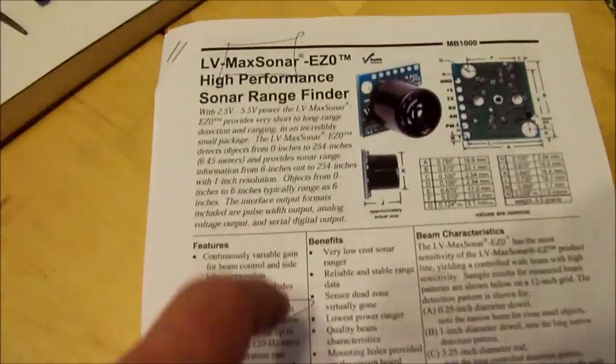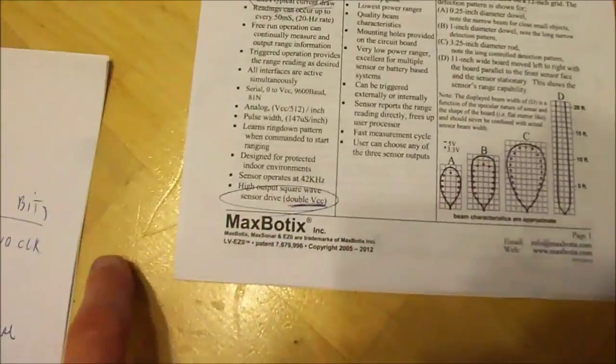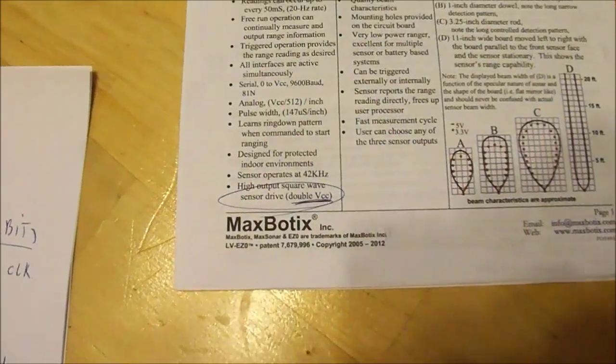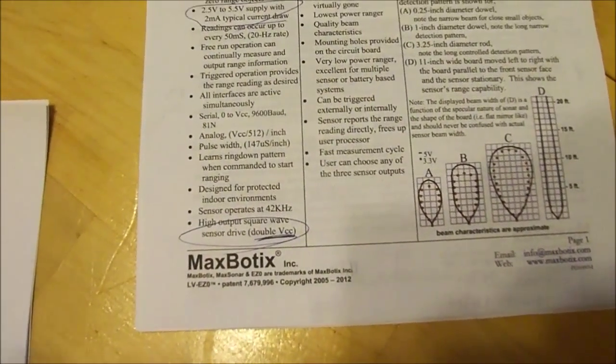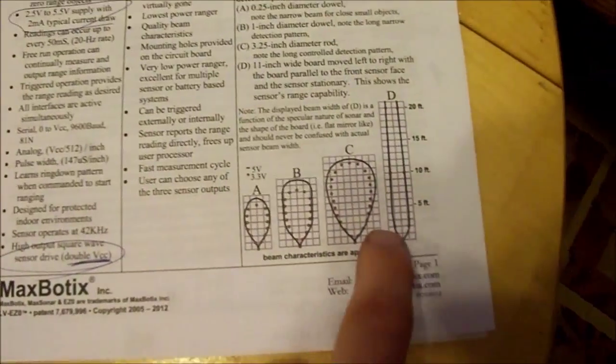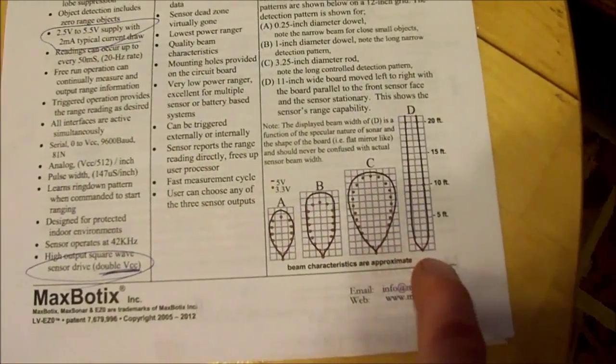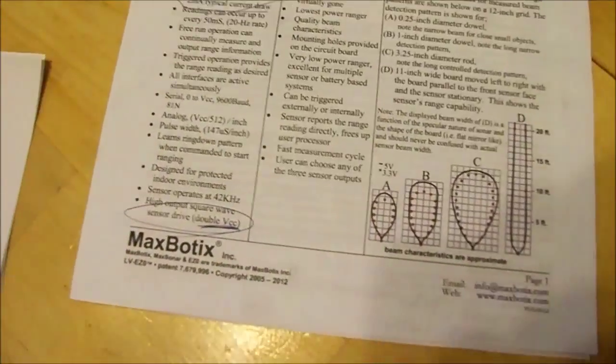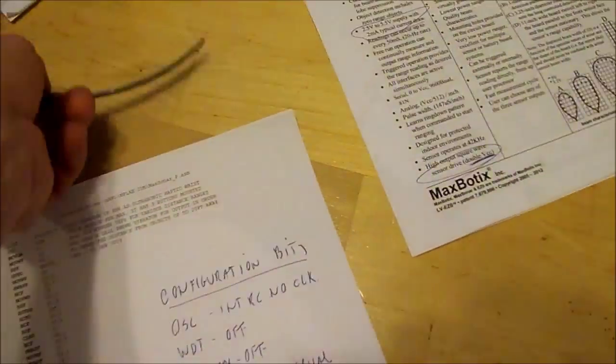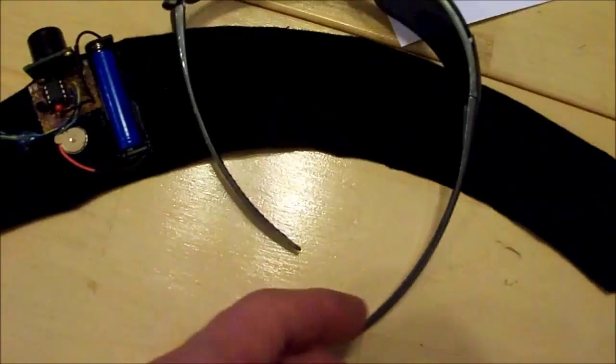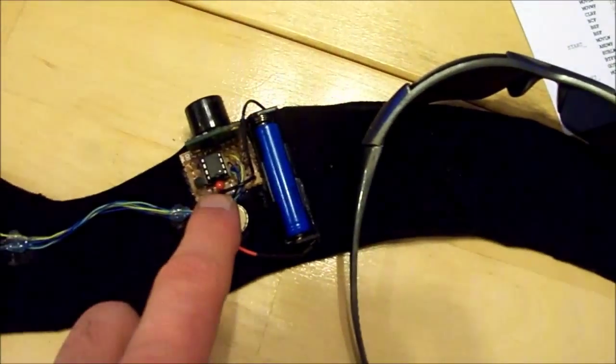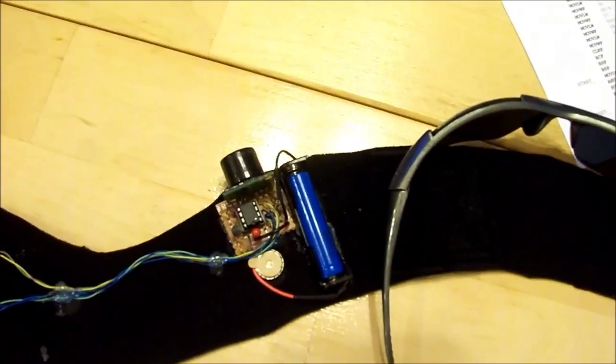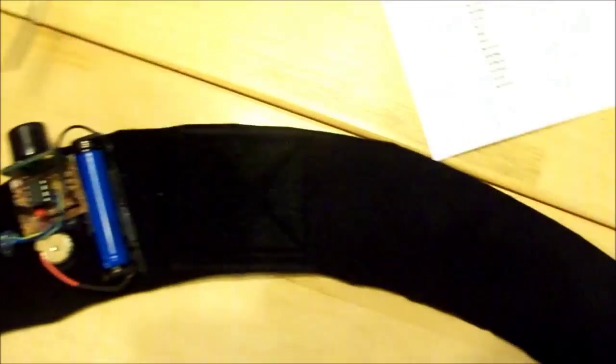This green component right here, I have no skills to build that. That's the sonar rangefinder. I got it off these people and it was about $29. It's the smallest unit I could find. I think it could fit inside a pair of glasses if you shrink this technology down with surface mount technology.